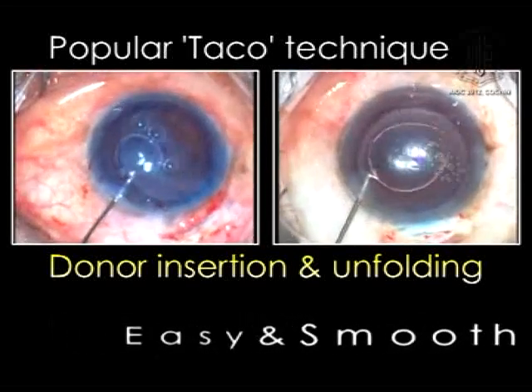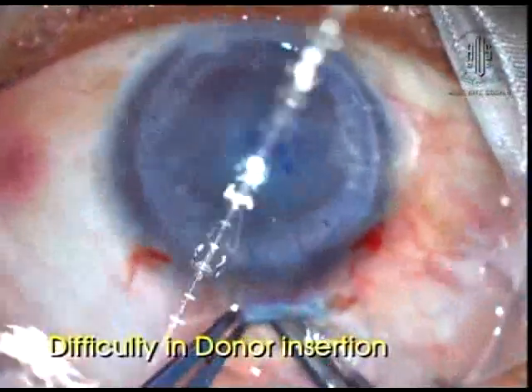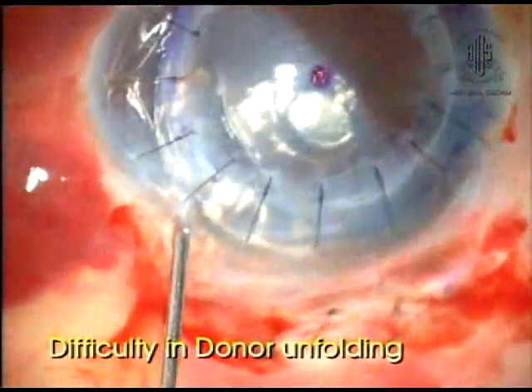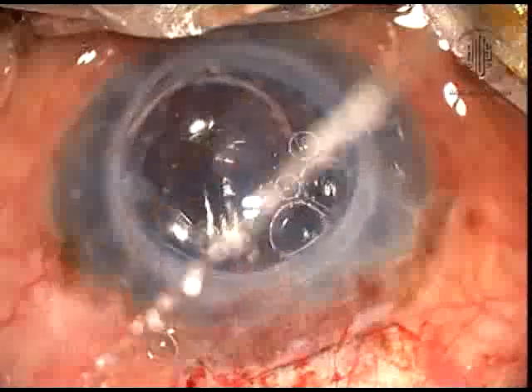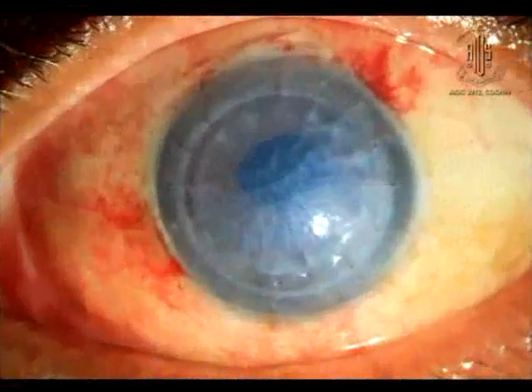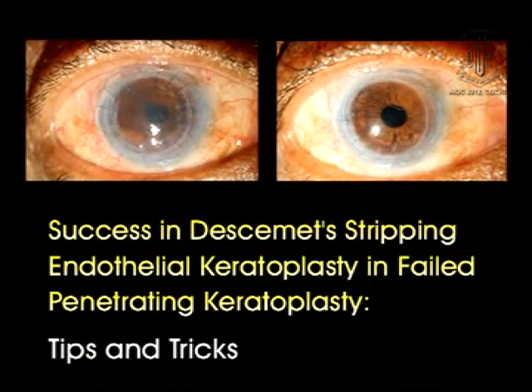But DSAEK in failed PK has different problems during surgery, like difficulty in donor insertion, donor unfolding, donor centration, shallow anterior chamber due to low scleral rigidity, and donor dislocation is higher. This video demonstrates some tips and tricks during surgery to achieve a better result in these cases.